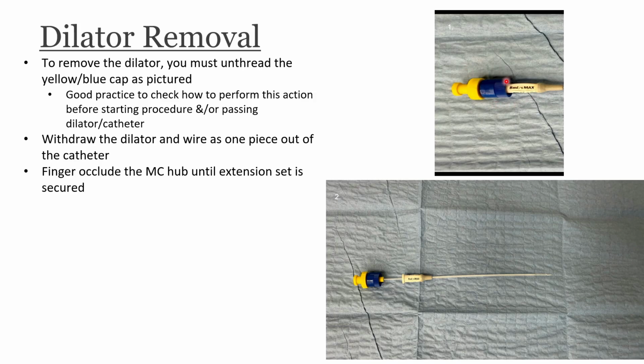It's got this little indication here for the max flow rate. So you may want to check with your radiology department at what they run the CTAs at. In our facility, it's about 4 to 5 milliliters per second on our max volume CTAs. This one would be just fine since it's 8 milliliters per second maximum.